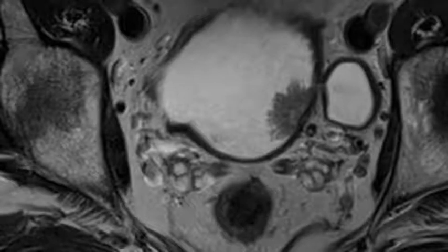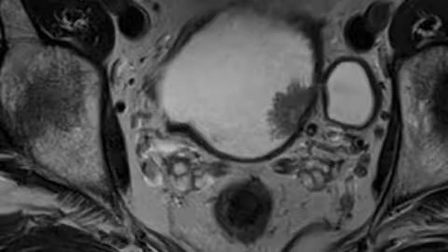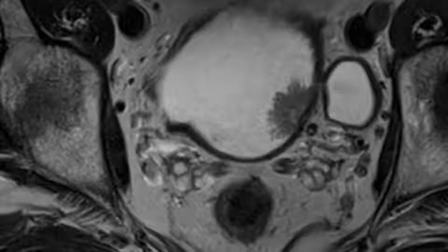In patients with superficial or papillary tumors, this layer of detrusor muscle is uninterrupted. In patients with muscle-invasive tumors, however, the low signal intensity of detrusor muscle is interrupted by the tumor. In patients with extravesical disease spread, a clear extravesical mass can be seen in stage T3B disease, and adjacent organ invasion can also be visualized in stage T4 disease.